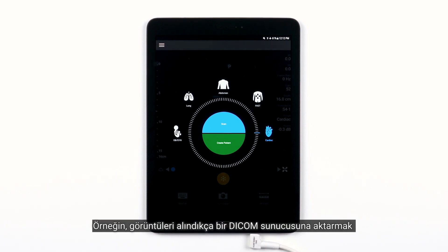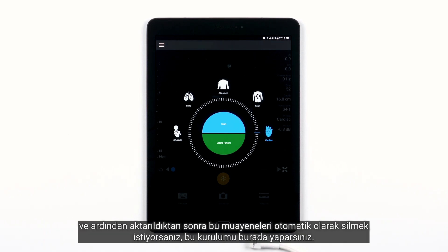If, for instance, you want to automatically export images to a DICOM server as they are captured, and then auto-delete those exams after they are exported, this is where you would set that up.